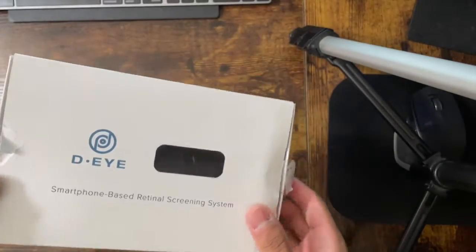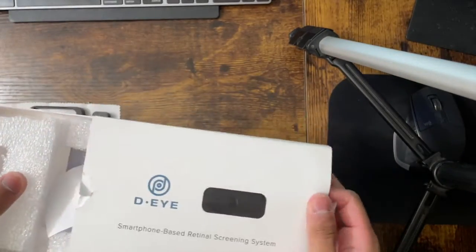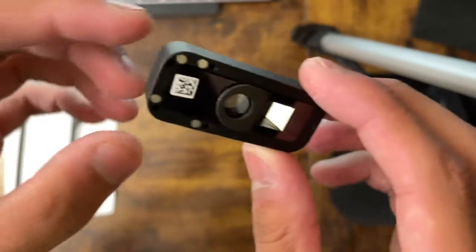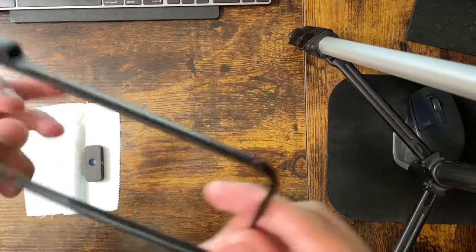This is an instructional guide on how to use Drishti's smartphone retinal camera rig. This is the packaging that the retinal attachments will come in. This first piece is the retinal camera attachment that is going to clip onto our iPhone. It has the lens and the mirror, and it's housed in a plastic casing.